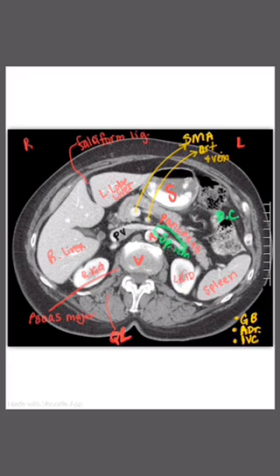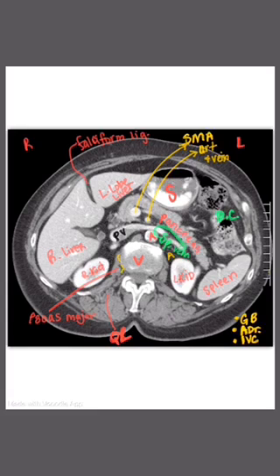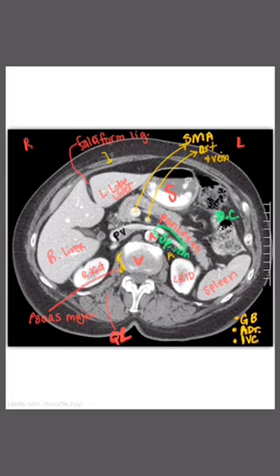If we did have the adrenals, they would be right here above the kidneys. Remember, the psoas major muscle is sort of beside the vertebral body. And if we were asked what these muscles out here are, that would be the rectus abdominis, and these over here could be the external obliques.